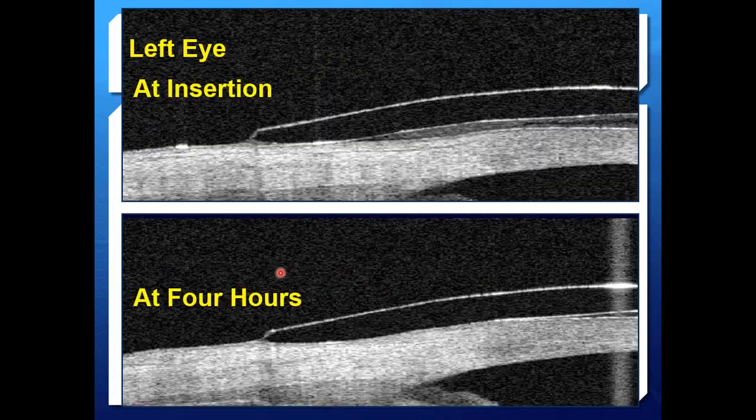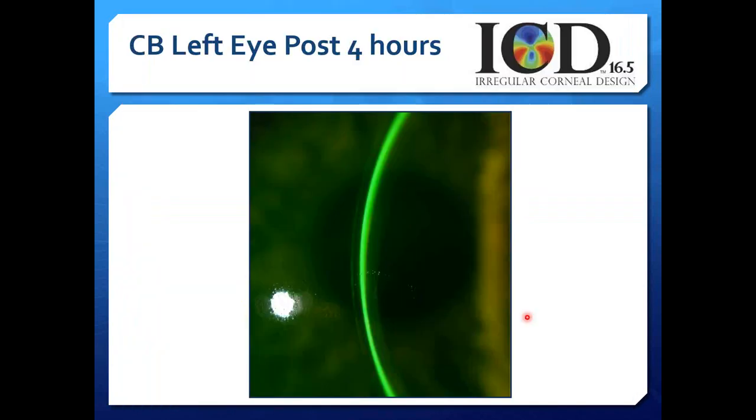Then on the nasal side, we've got the lens on insertion sitting up high and proud, but notice what happens after settling. That lens sinks itself into that very soft, boggy conj, and we've actually lost a lot of that limbal, that peripheral cornea and limbal clearance we had. It's now turned into touch. So this lens might require some modification. We might want to call up our ICD distributor and increase that vault.